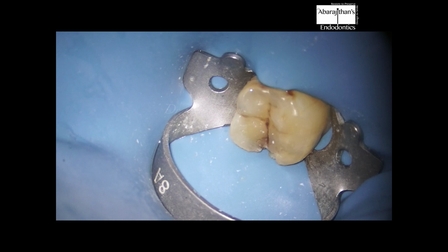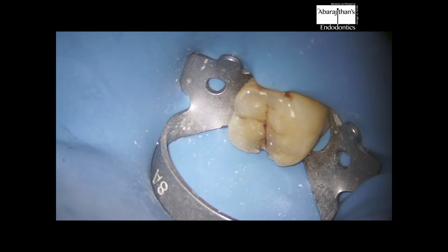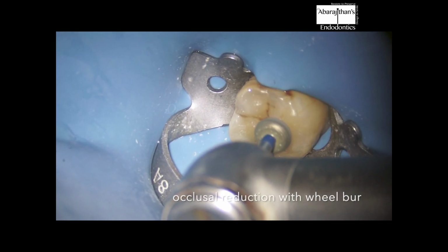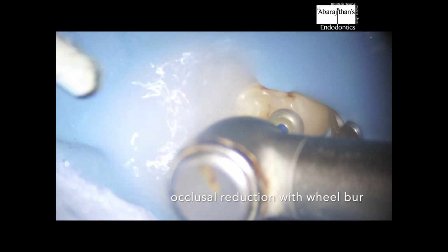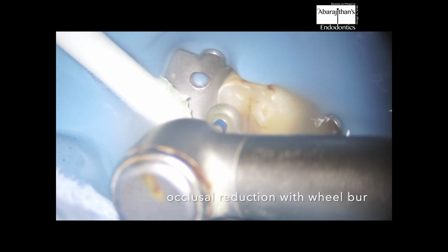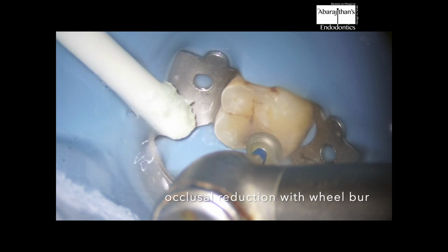So the most important aspect is rubber dam isolation. So with rubber dam, the one tip that I can give you guys is to do the occlusal reduction rather than using any of the straight fissures or tapering fissure burrs.